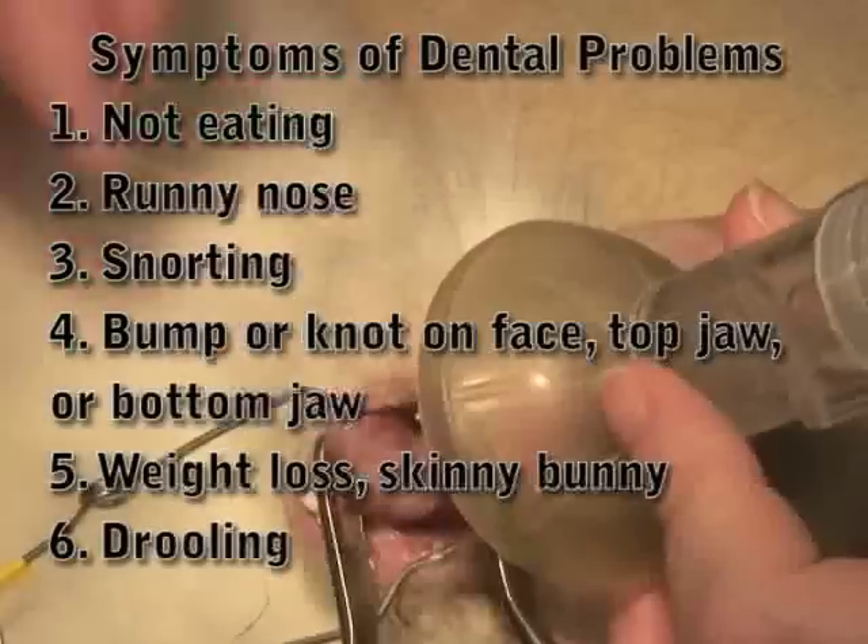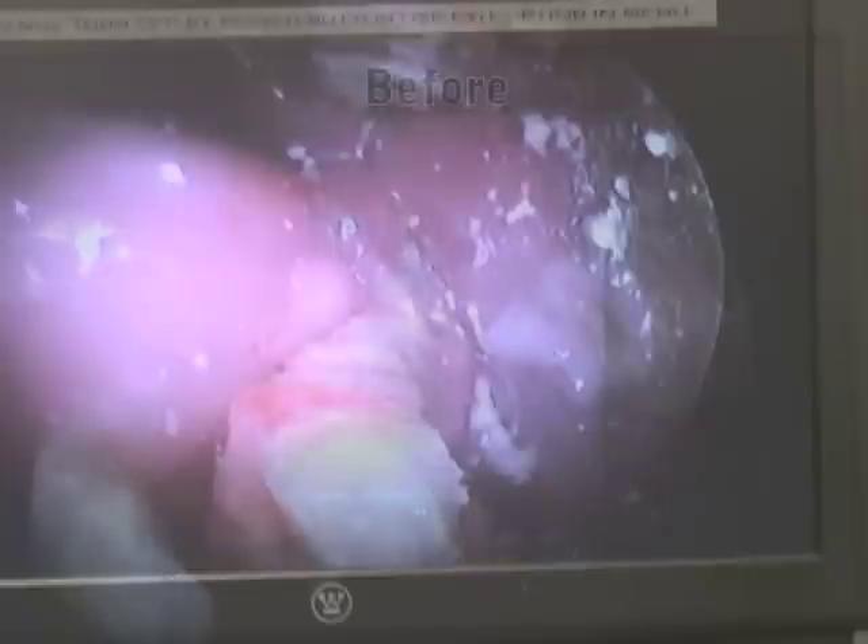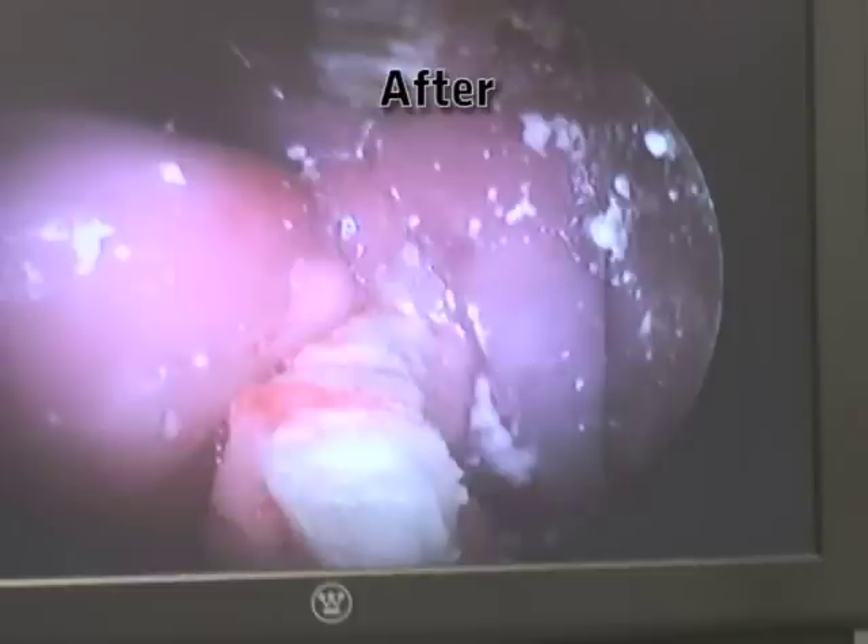Let's see if we can put that on the big screen. This is that same side where we had that really long tooth. We've trimmed that tooth down, and now you can see all the teeth are pretty much the same level. We've trimmed them back a lot. We've trimmed the point off that back upper molar right back here. That side actually looks pretty good.